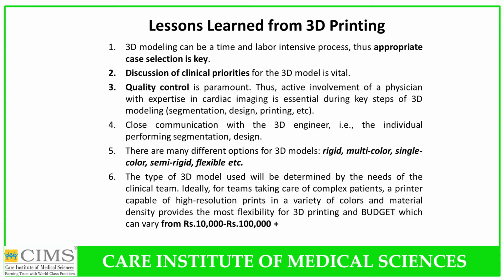Lessons learned from 3D printing include that appropriate case selection is key. Discussion of clinical priorities is very vital. Quality control is of paramount importance. So active involvement of the cardiologist with expertise in cardiac imaging is essential during key steps of 3D modeling such as segmentation, design, and printing. Close communication with the 3D engineer is very important.